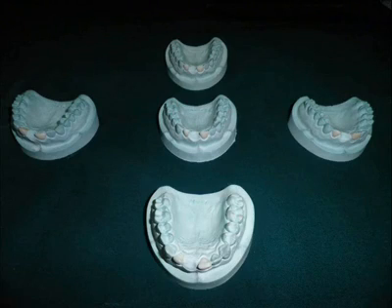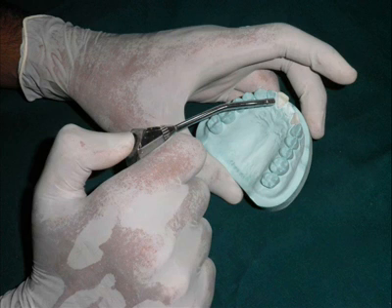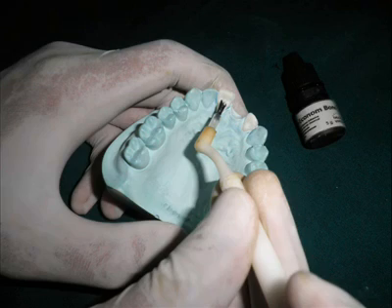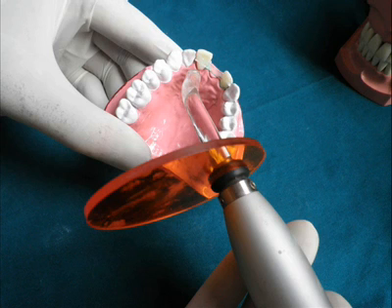Simulation of procedure on models. The palatal surfaces of teeth adjacent to the edentulous space are prepared minimally using a thick round bur for adapting resin impregnated fibers. The surfaces are dried using a three-way syringe and acid etching is done using 37% phosphoric acid gel for 15 to 20 seconds, followed by subsequent rinsing and drying till a white frosty appearance is seen. Bonding agent is applied later and a bundle of fiber of sufficient length is cut and spread on palatal surfaces and light cured.